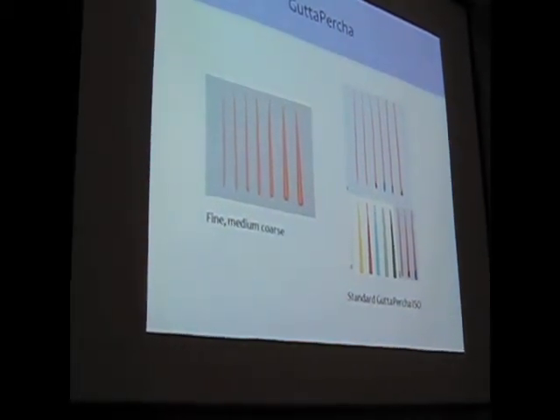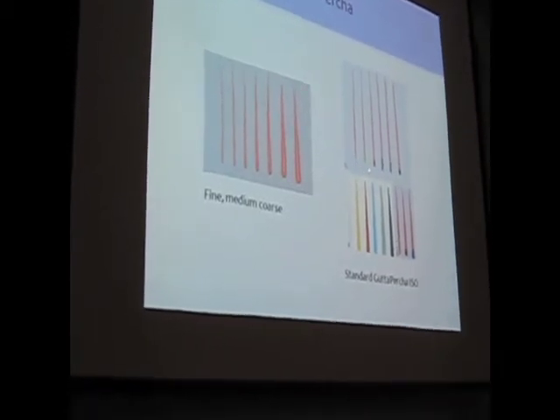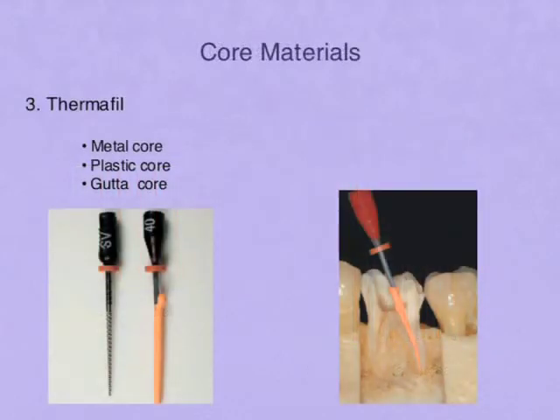This is standardized gutta percha cone, 15, 20, 25, and so on. This is .02 taper, this is .06 taper, and this right here is pro tapered gutta percha. So it goes with F1, F2, F3. All companies have their own files, their own specific paper points, and laser verified gutta percha, so you could use any of those. Thermafil. Thermafil is basically carrier-based gutta percha that Dentsply came out with.